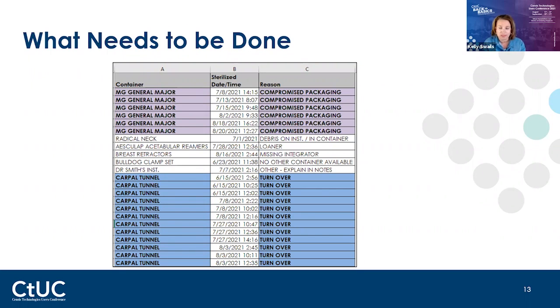Fortunately, here again, these are basic stainless steel instruments, so not really expensive. And that's typically the case. A lot of your stuff that's not your basic stainless steel can't be IUSS anyways. So you just have to really drill down, look at it, and then see what's going on.